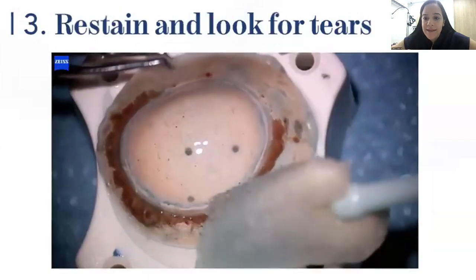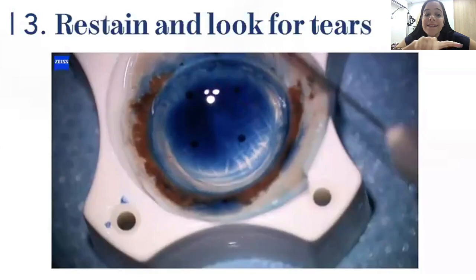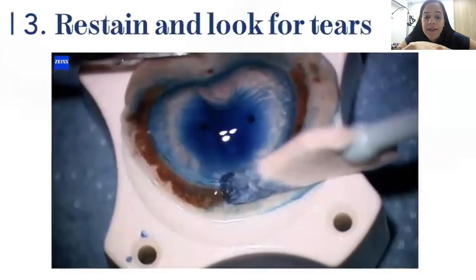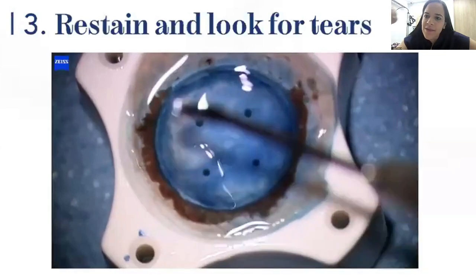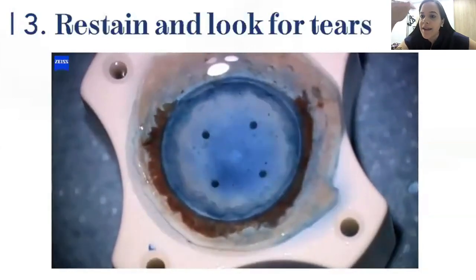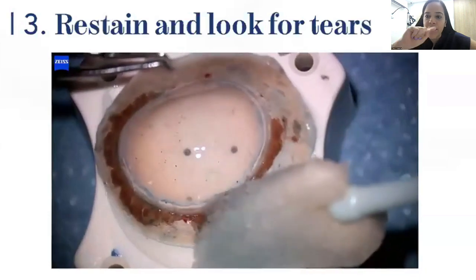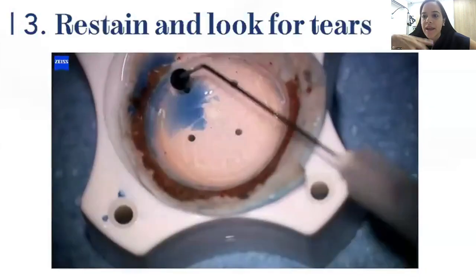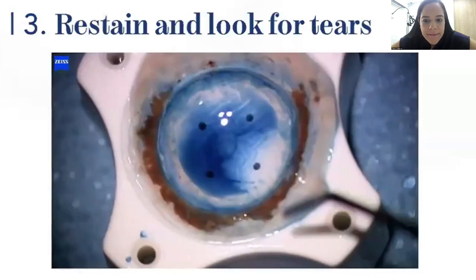Now we remove the BSS and we restain. Why do we restain? So we can see the borders of our graft to see if there's any tear. And then we put BSS, and also you can see with the movement how it's moved and if you have any tears. As you can see in this graft, it didn't have any tears, but you will see it's staining, and then you say, okay, then I have a tear there, and you have to be careful with that side.